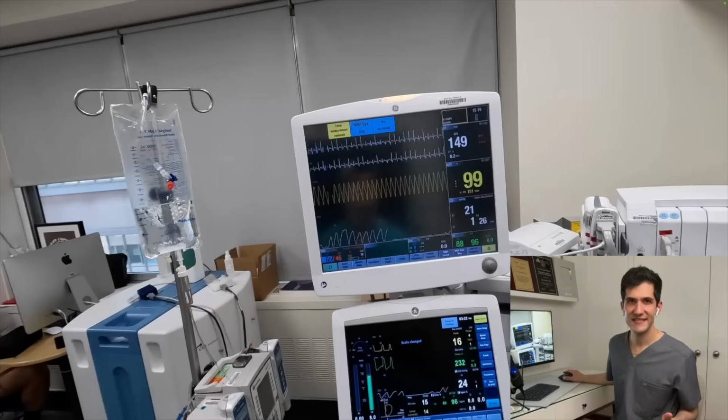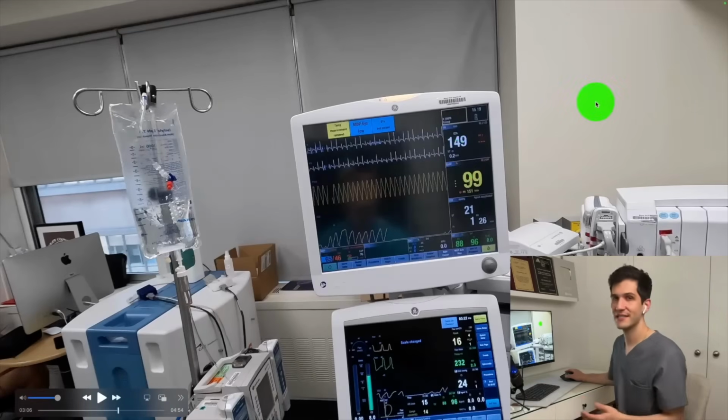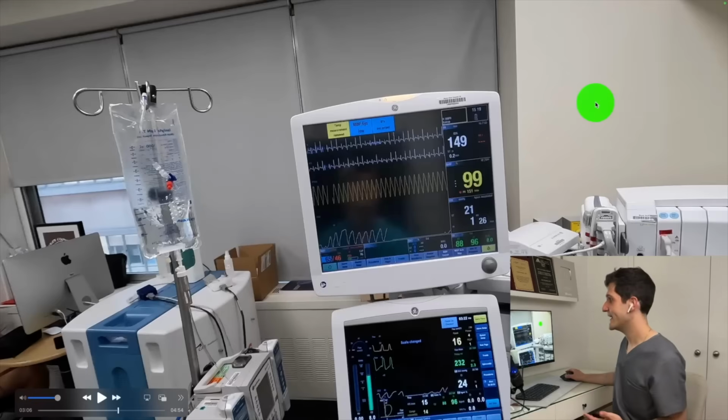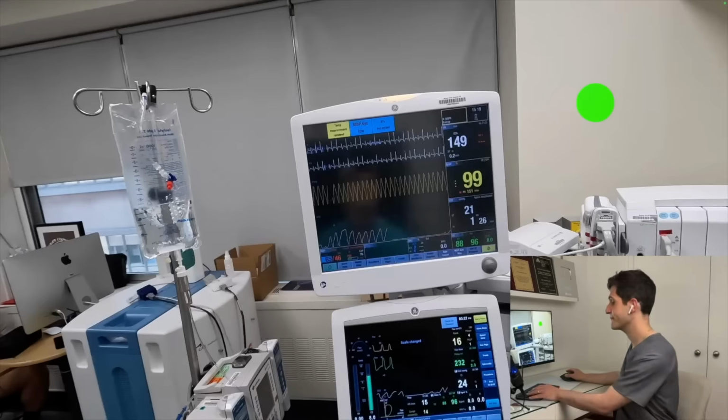Again, I'm constantly scanning the monitors to make sure that the vital signs are appropriate, and here I'm pretty happy with it. You can see that the heart rate is pretty fast, but that's not surprising because I had administered atropine to increase the patient's heart rate. And my next move here is going to be securing an airway because I want to make sure that there's no issue with laryngospasm before the paralytic wears off. And then after that, the next big priority is getting IV access so I can administer medications in the most effective way possible.